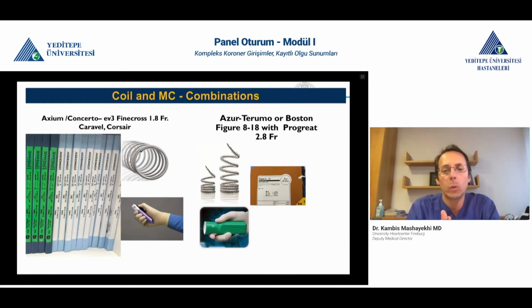What you also have to understand is that this coil is reducing flow. It's not that you occlude immediately. Well, that would be the goal, but sometimes the reduction of flow is already enough, and you have to wait a little bit until the effect is coming, right?